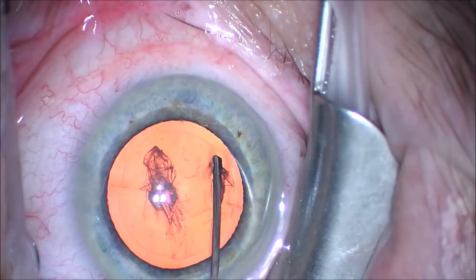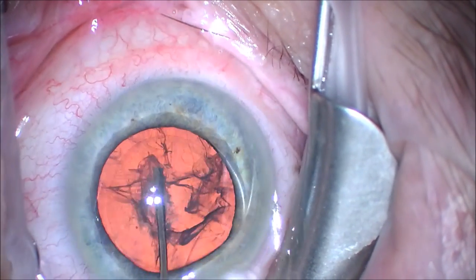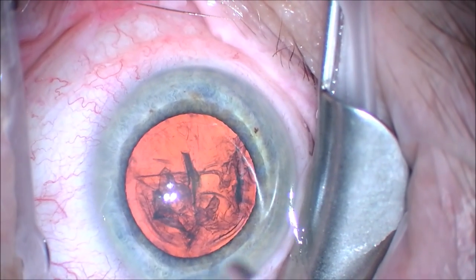We perform hydrodissection — that's injecting salt water underneath the anterior capsule to free the capsular contents, which is the cataract, and make sure we can rotate it freely.